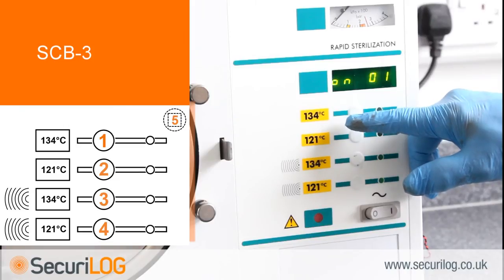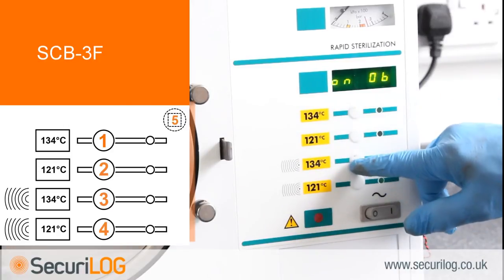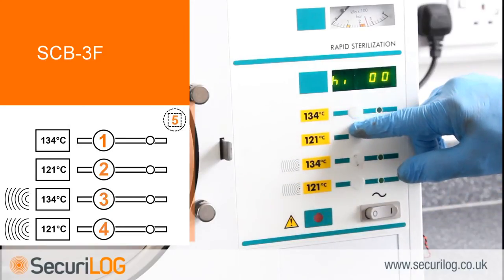Now set up the month of manufacture. The month is made up of two numbers: January is 01 through to December 12. With the display reading ON01, press button 1 to begin selecting the required number. Button 1 increases the number, button 2 decreases it. When the number displayed is correct, press 3 to select. The display will now read HIGH00.